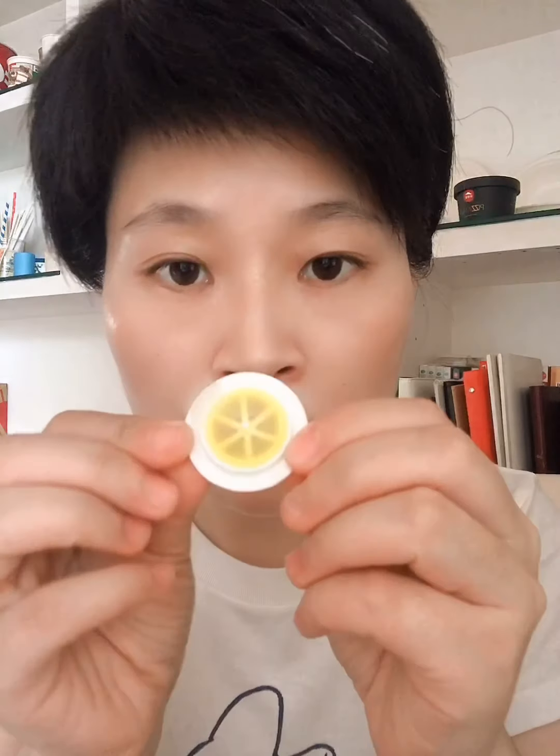And then you will take the valve. It is 3 parts, okay? Then we put the silicone pad on the bottom, like this way. Here is a hole. Then we put it across the hole. I think it's enough. Almost. Then make this part.